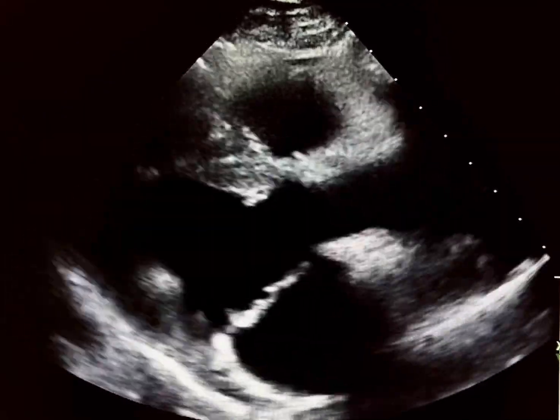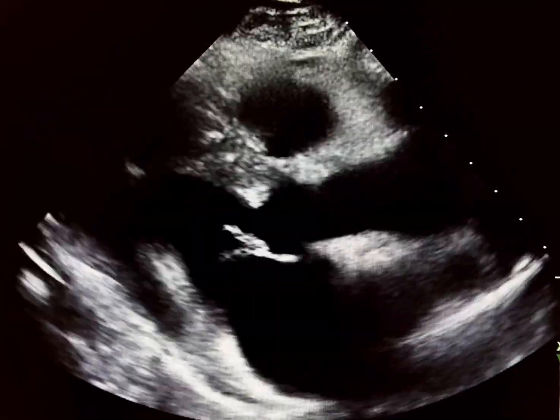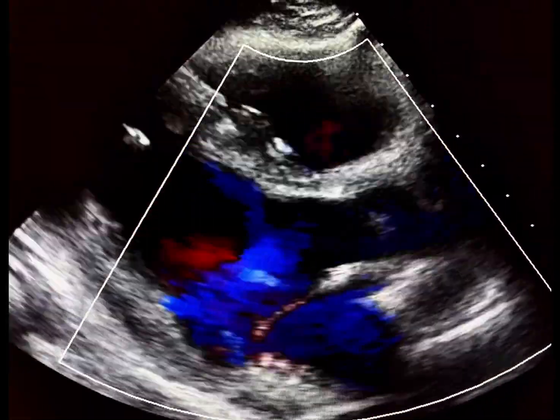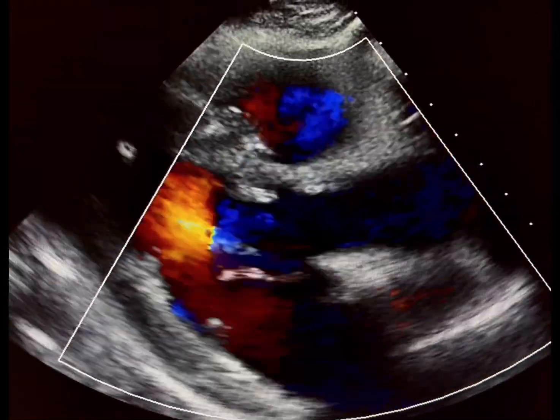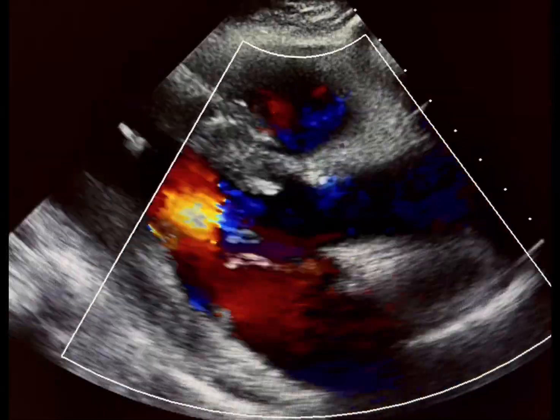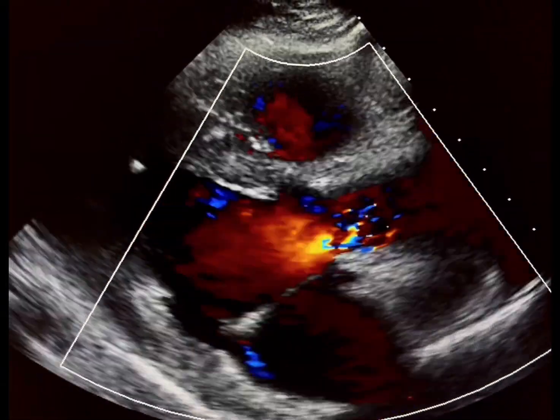This echocardiographic video belongs to a patient who previously underwent aortic valve replacement, AVR. The striking finding is significant turbulent flow with markedly elevated transprosthetic gradient across the bioprosthetic valve. At first glance, this may raise concern for prosthetic valve dysfunction.